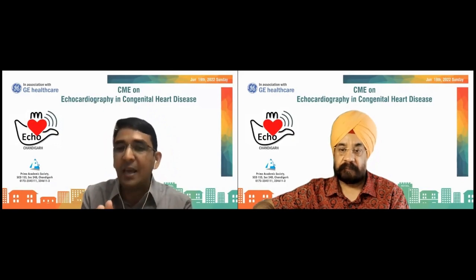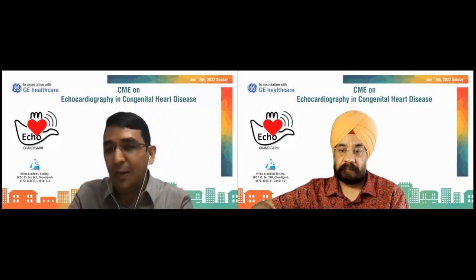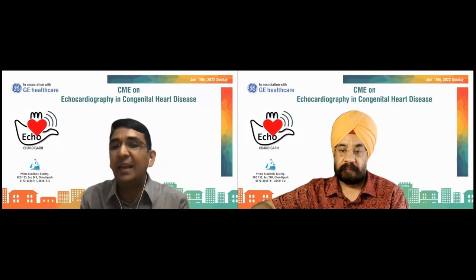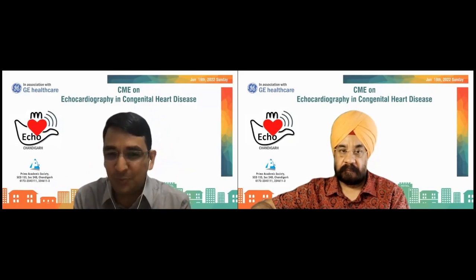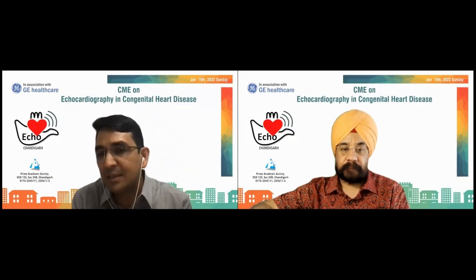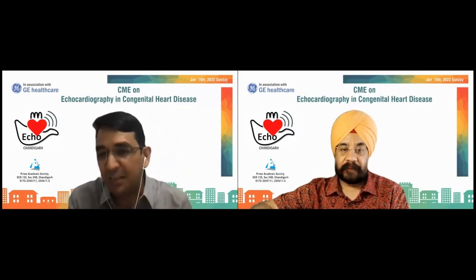So DORV can be labeled as TOF-like DORV. I would say that practically that is the best balance you can achieve while writing a report. DORV, TOF-like. That solves the issue because your aim is not the semantics. The aim is to treat the patient.